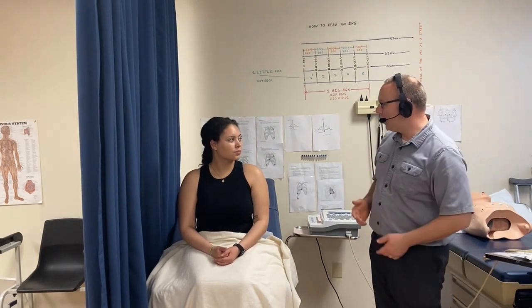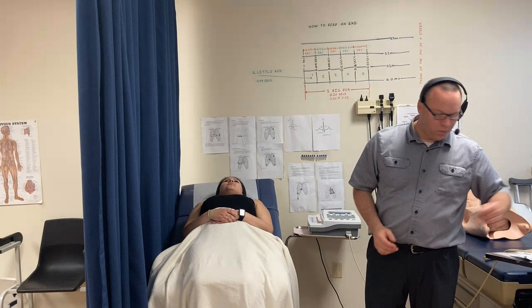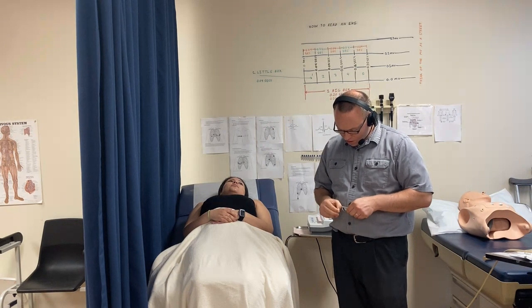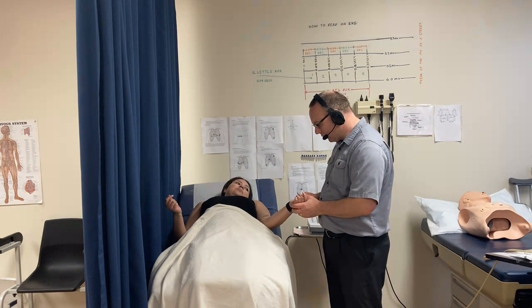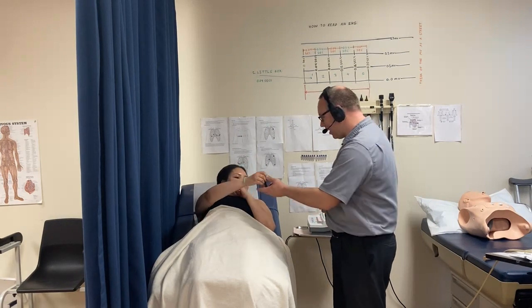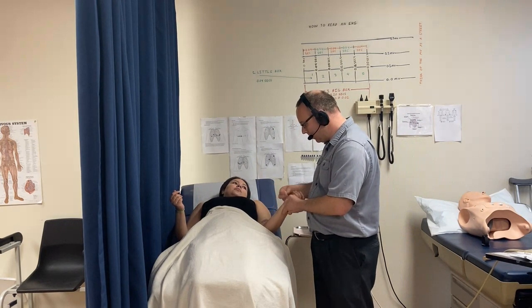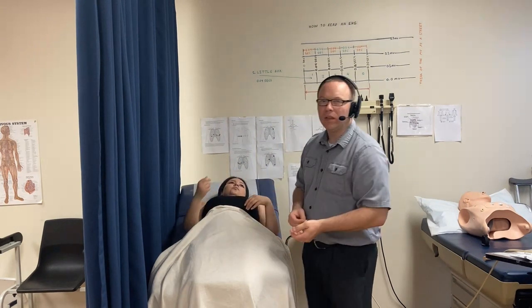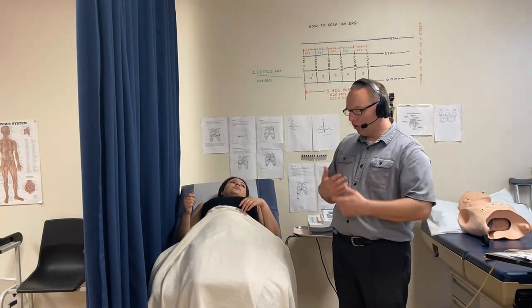We're going to assist the patient in lying back. Once she's laid down, take your alcohol swabs and swab the inside of her wrists and ankles. Our body has natural oils — and make sure to remove any smart watch — because those natural oils will stop the EKG machine from working. Use the alcohol swabs liberally with a little pressure, scrubbing back and forth to make sure all those oils come off.